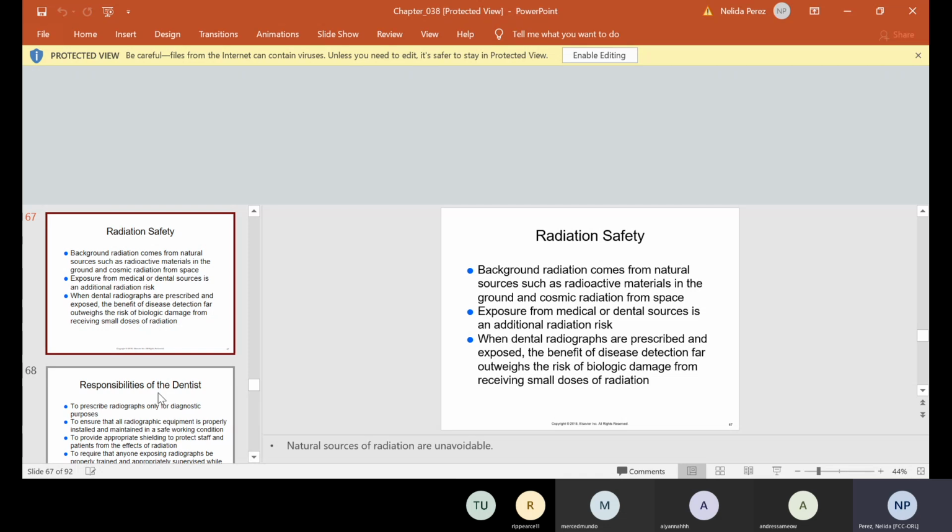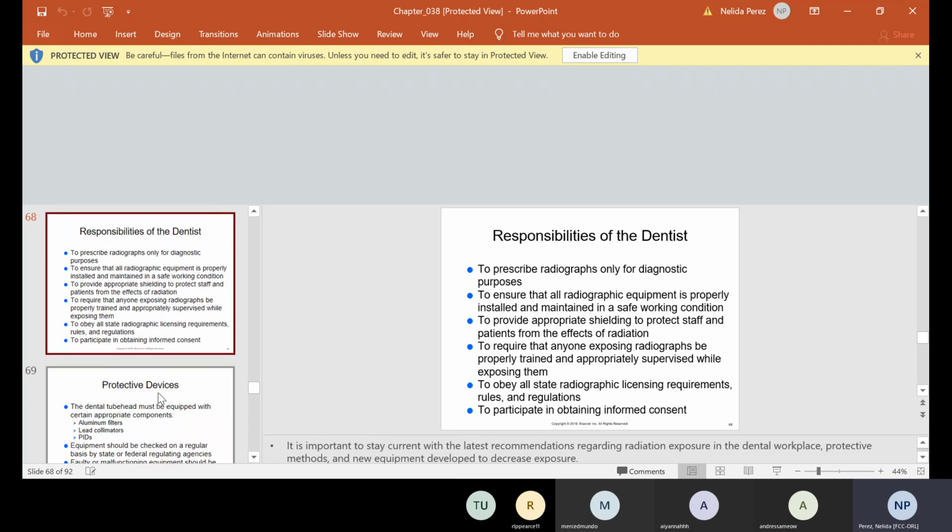If he says that for every checkup patient he wants 4 bitewings, he is prescribing 4 bitewings. If he tells you that for every emergency that comes in he wants a PA x-ray, then that is what he's prescribing. Don't take whatever you think you want to take. You take what the dentist prescribed. You're under supervision. Exactly. And you'll figure it out when you're with the dentist.